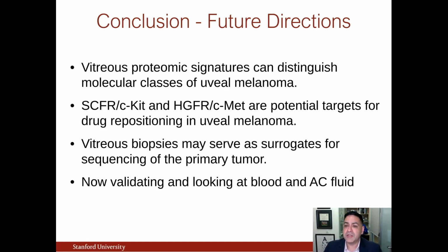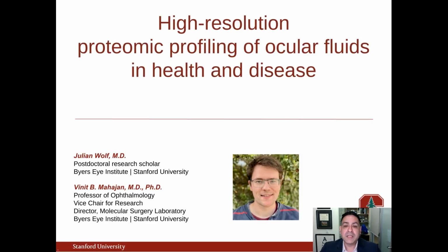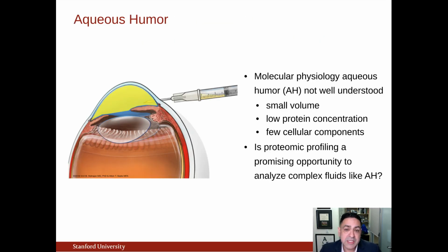So let me switch gears now to some of the work that's been done by Julian Wolf, a postdoctoral fellow in the lab, now looking at high-resolution proteomic profiling. So the images and studies that I've been showing you up until now are where we've been biopsying the vitreous fluid compartment during surgery. As a retina surgeon, if the patient comes into the operating room, this is the kind of fluid that we're typically able to get.